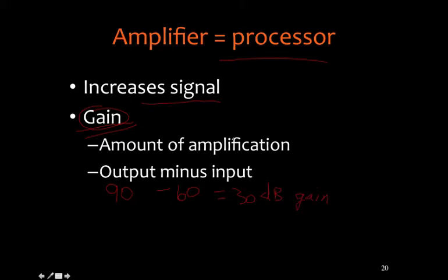And so in that case, at that particular frequency, modern hearing aids, contemporary sales of hearing aids, require that these sorts of measurements, gain measurements, and other electroacoustic measurements of hearing aid performance be completed at various stages in both manufacturing and in the sale of hearing aids.